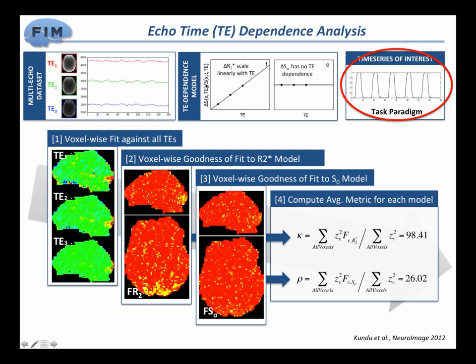Well, no signal is going to fit any of these models perfectly. The hope is that it would fit one much better than the other. But as I will show, sometimes the algorithm may also break. This is just one way in which you can automate a lot of things, and it tends to work quite well in many instances, but it's not perfect on real data.